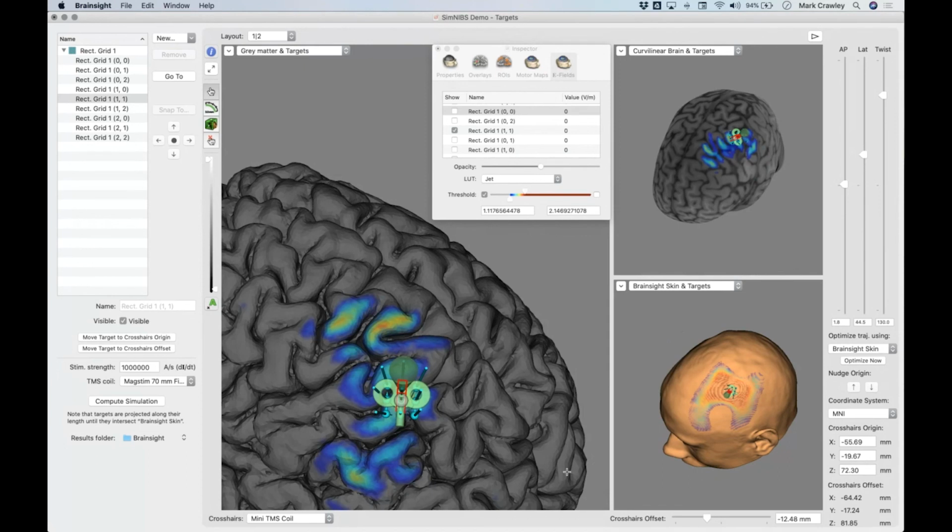There's one more now. Let me just filter through. Do you have a recommendation for the type of Mac PC? They're using a beta version of Brainsight on my PC, and it works slow with SimNIBS. That might just be because SimNIBS takes a bit of time to run the simulation behind the scenes. But I'll let you answer that in detail.